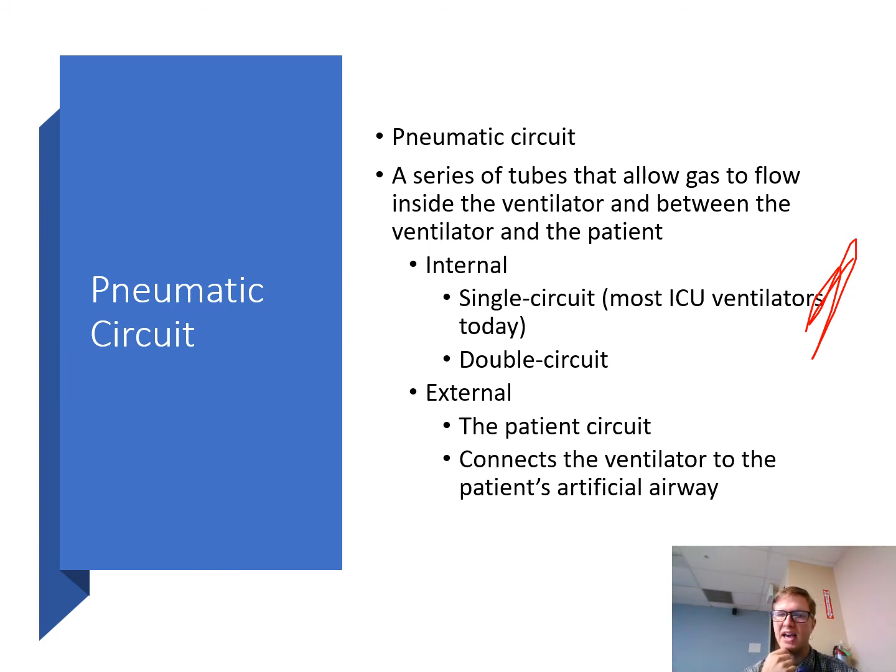So we know that gas is being delivered only to the patient. It's not going just through the ventilator machine and through the inspiratory limb into the expiratory limb. It's going to the patient. During exhalation, the flow of the ventilator stops, and the charge line depressurizes, so it stops pressurizing the charge line, and the exhalation valve then opens and allows the patient to exhale. So they're able to exhale passively through the expiratory part. So that way the patient can completely exhale, hopefully.